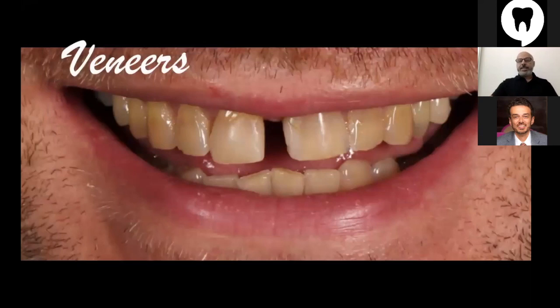Also, we can do a set of veneers with the CAD-CAM, of course, all in office. Of course, it takes more time. It's one day, a whole day actually. I call it a day used in the clinic for the patient to make such a case, to finish all the veneers in one visit. It's a bit of a hassle, of course, but it's enjoyable at the end.